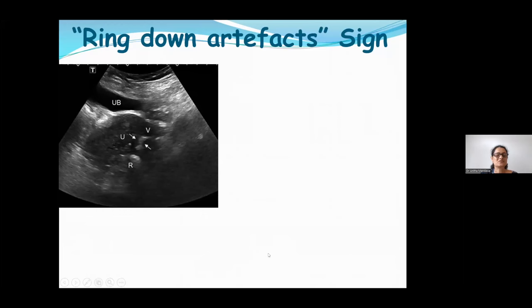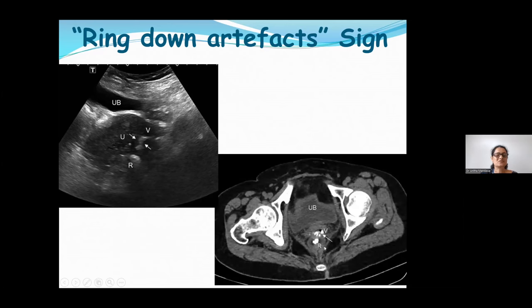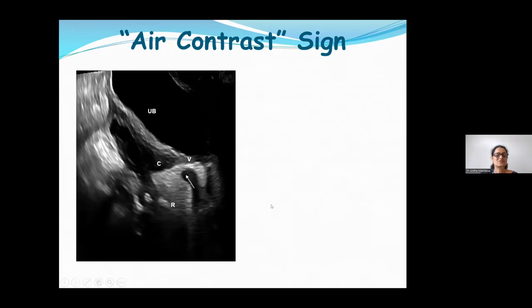Ring-down artifacts: some gas-containing fistulas show irregular tracts of discontinuous hyperechoic foci with posterior ring-down artifacts. When ring-down artifacts are seen between two adjacent structures with indistinct fat planes or cleavage planes, you should suspect a fistula. Here, with a partially distended urinary bladder, uterus, vagina, and rectum, a rectovaginal fistula is confirmed on CT. Ring-down artifacts are an important clue to look for.